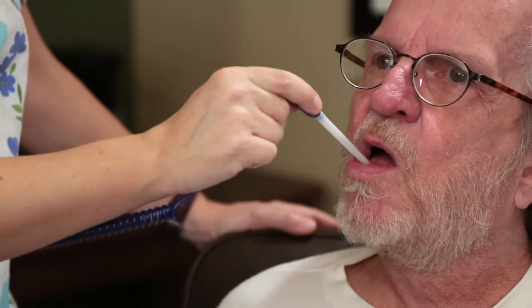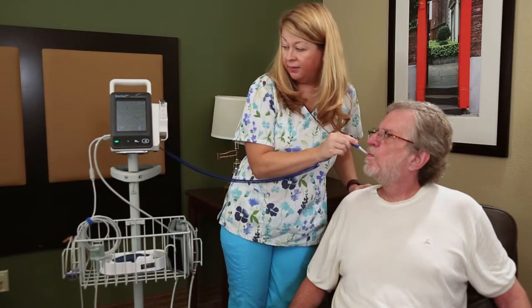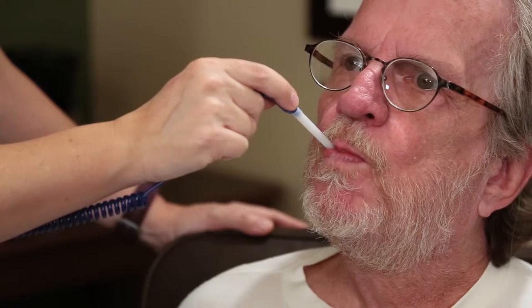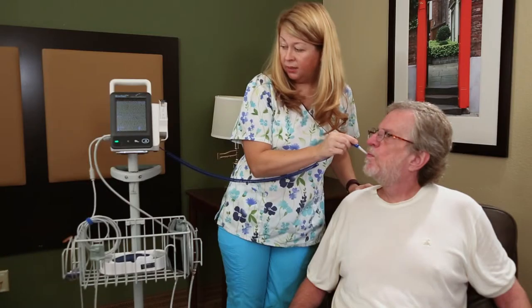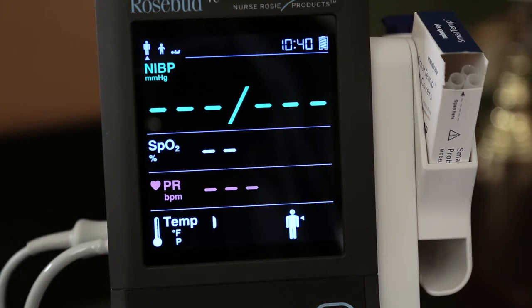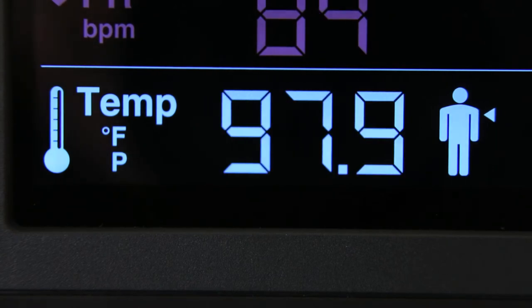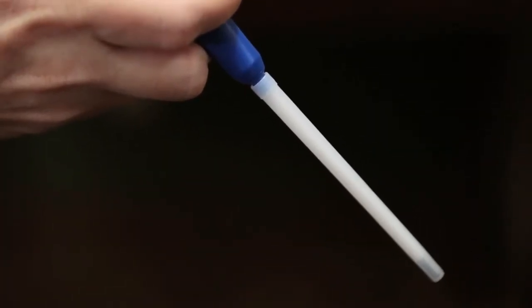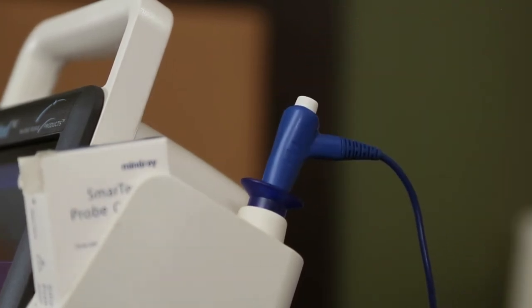Make sure that the probe reaches the rear sublingual pocket. Have the patient close his or her lips to hold the probe, and use your hand to hold the probe in place. Make sure that the probe contacts the patient's oral tissue throughout the measurement. When the segment moves clockwise, it indicates that the monitor is taking the measurement. The monitor sounds a beep when the temperature measurement is complete. Withdraw the probe, firmly press the ejection button on the top of the probe to eject the probe cover, and replace the probe into the probe well.